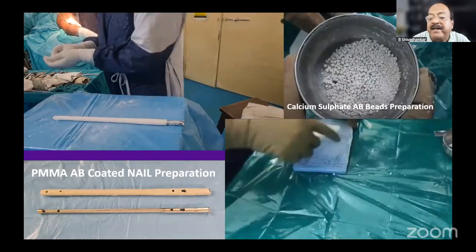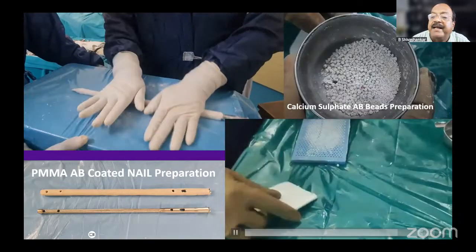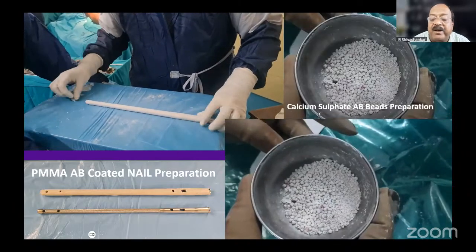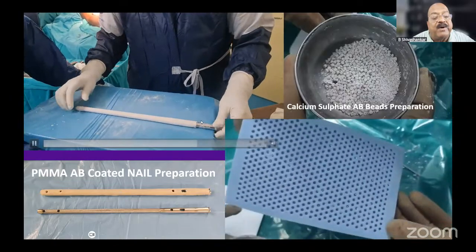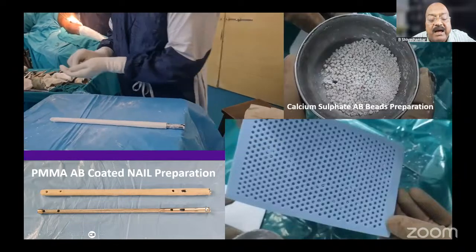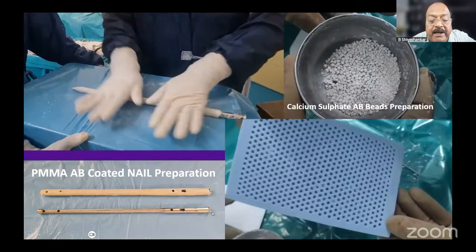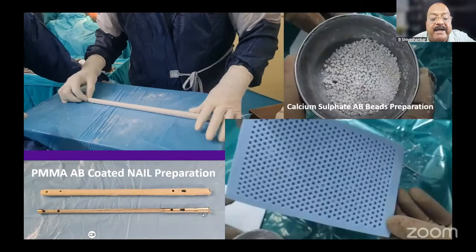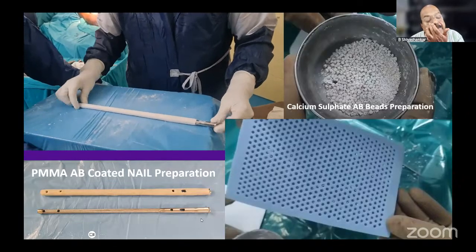And normally nowadays I use two antibiotics, one antibiotic for the cement coated nail and another for the stimulan beads or the calcium sulfate beads with another antibiotic to insert at the fracture site. So I use two antibiotic coated nails. The proximal most part of the nail is 13 millimeter here. The expanded portion is 15 millimeter. So where you keep the proximal end, accordingly the thickness of the nail can be changed.